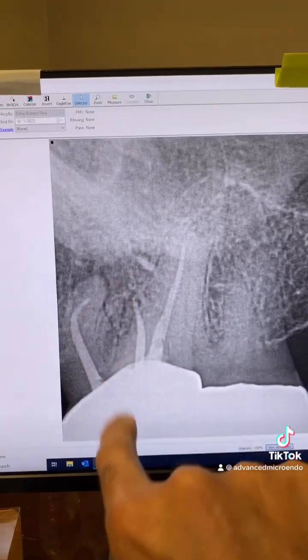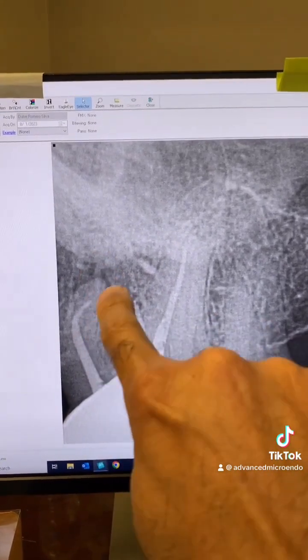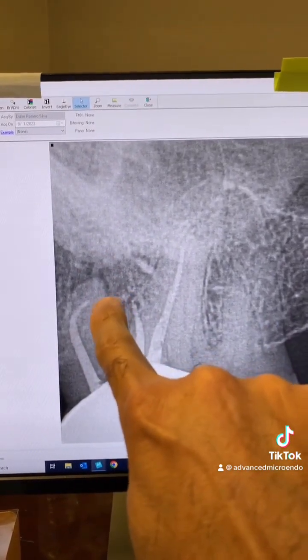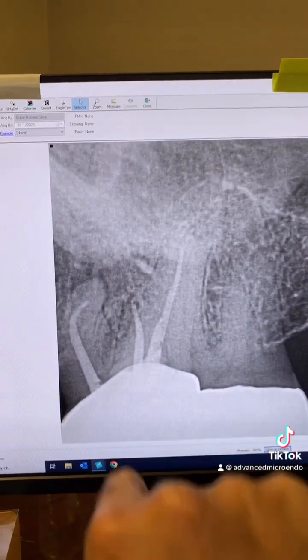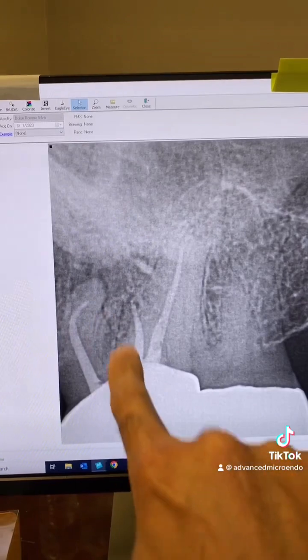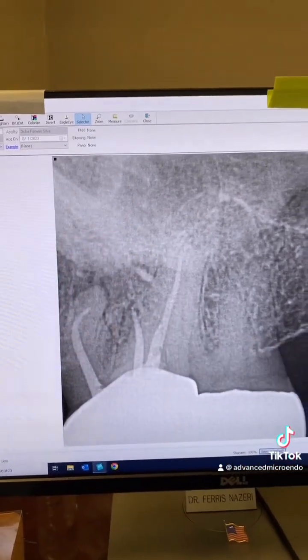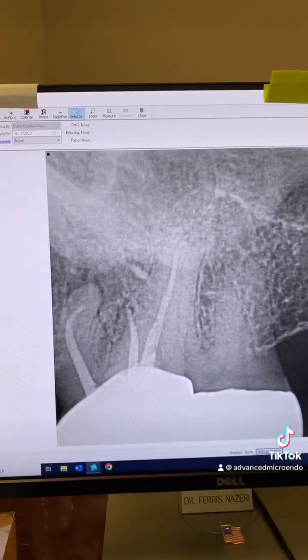90-degree curvature of the canal, short fill — he left necrotic tissue and bacteria behind. Missed MB2. Of course, you can see the peripheral lucency. There you go.